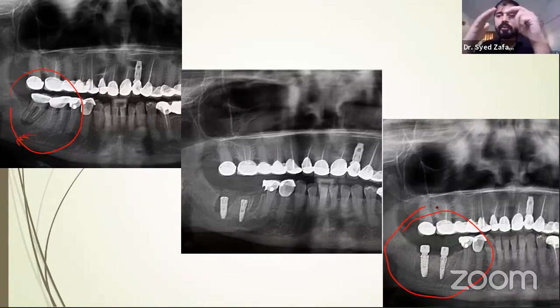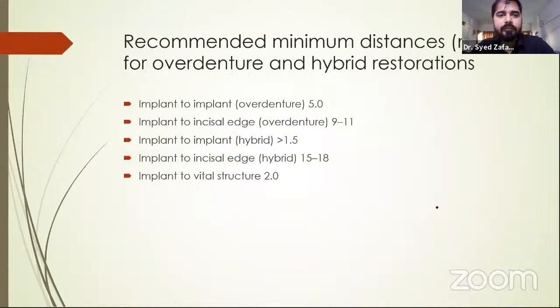If there is infected tissue on the soft tissue, I usually cut it with the scissor, because if the site is infection-free, there is a huge chance that the implant will heal. In my case, there is a huge result, as you have already seen in this picture.